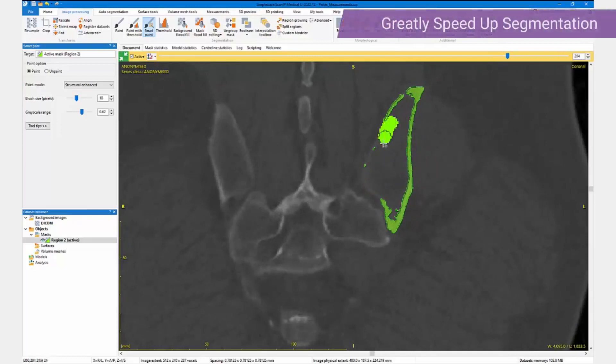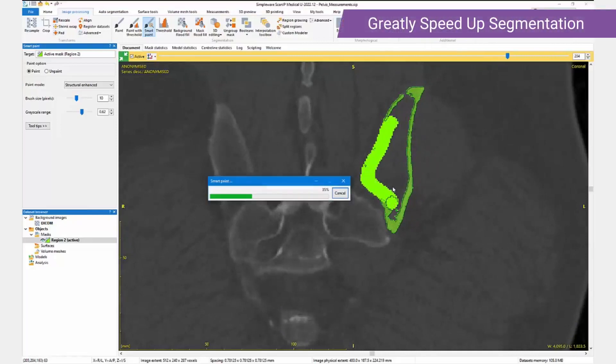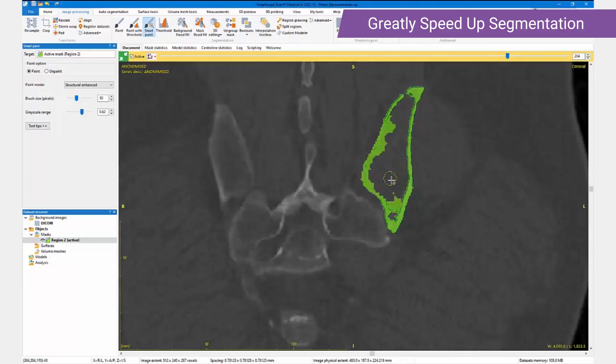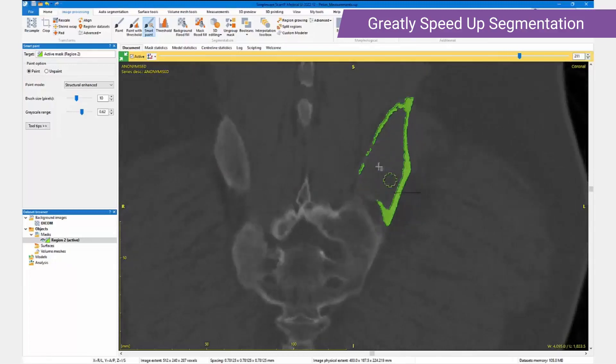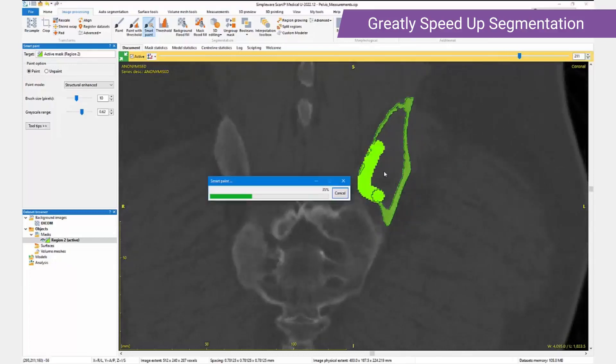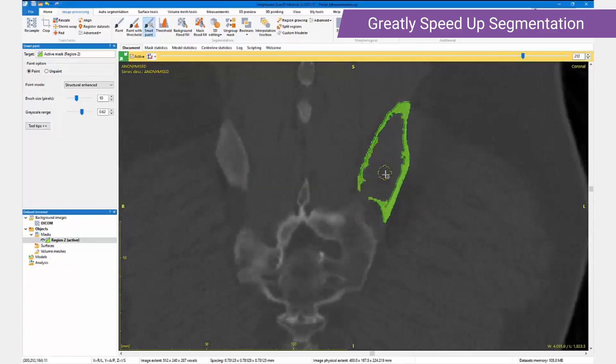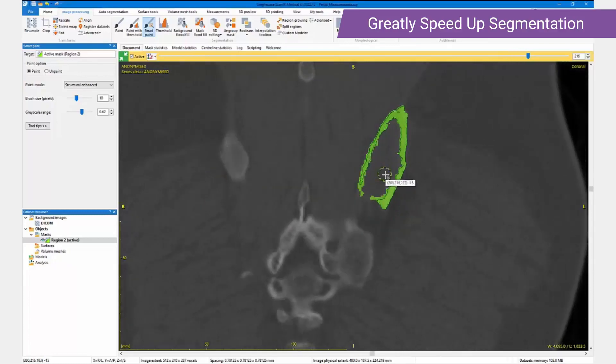As this is a three-dimensional paint brush, it dramatically speeds up the segmentation editing workflow, allowing the creation of a solid bone mask very quickly.